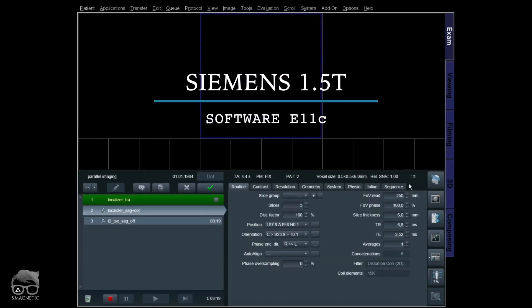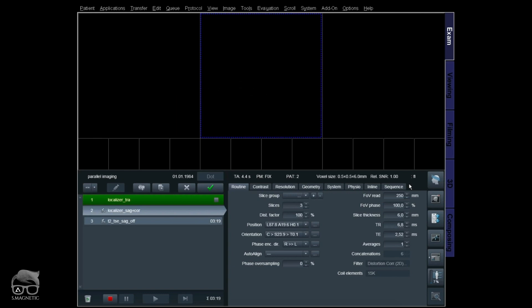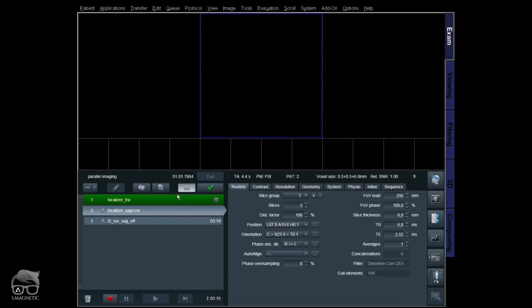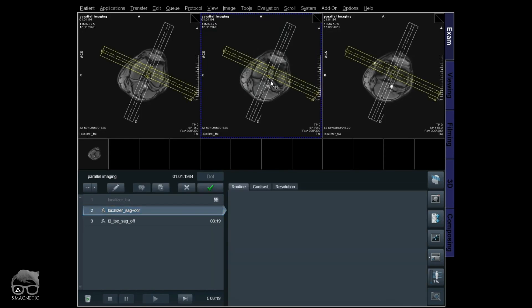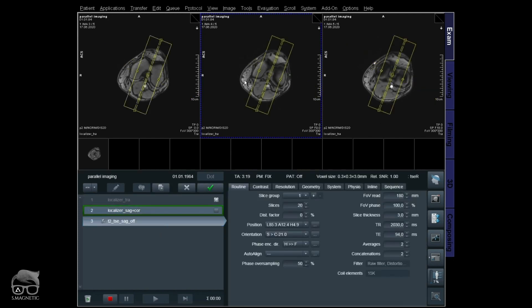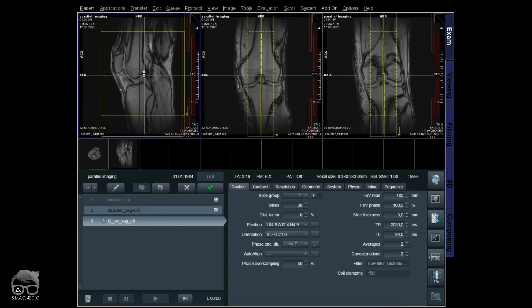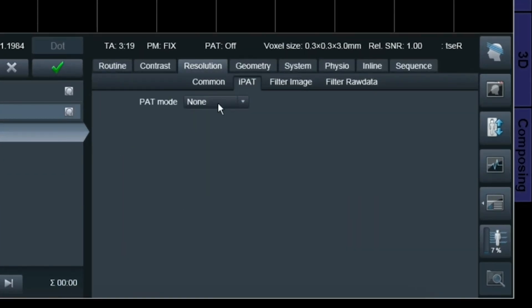We are live at 1.5 Tesla. Parallel imaging works the same on every field strength — the theory behind it is the same. I'm going to do a knee imaging here to demonstrate parallel imaging. I'll do a localizer to get a decent sagittal of the knee, then a T2 sagittal with just a few slices in the mid part to save scan time. The first sequence has parallel imaging off, and you can see the relative SNR is at 1.0.